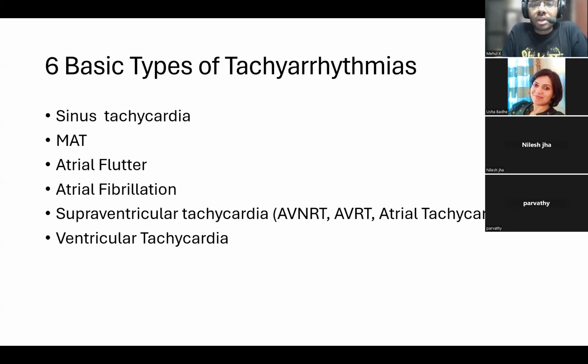And finally, ventricular tachycardia. So which one of these is broad? Ventricular tachycardia is always going to be broad. There can be some exceptions like idiopathic VTs, where the QRS complex is relatively narrow for a VT, but we're not going to go into that today for simplicity's sake, because that by itself requires another lecture. VT is the only one of these that is naturally broad complex.